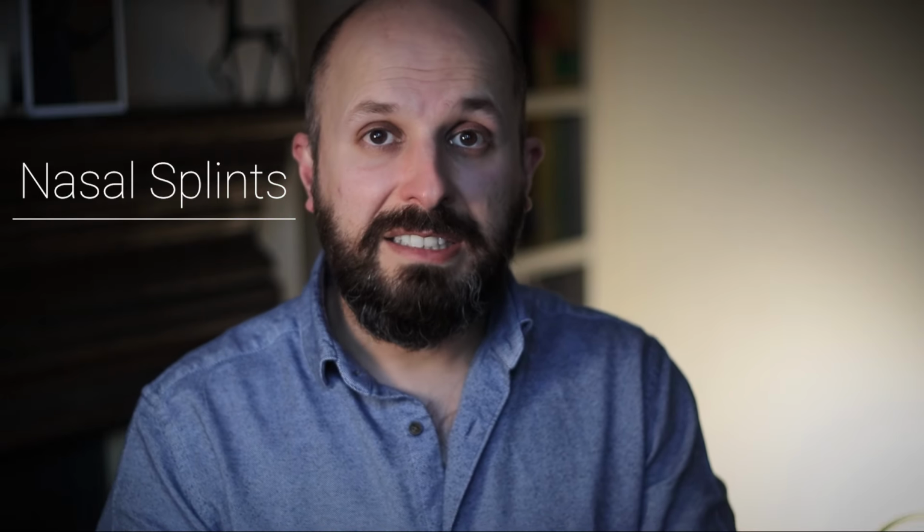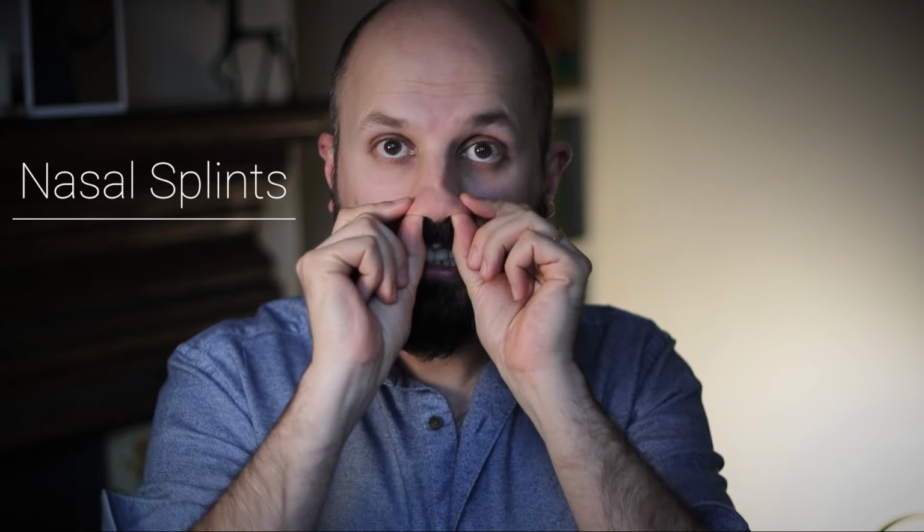Now there is a different type of nasal dilator, also known as a nasal splint. Instead of pushing something up your nose, it sits outside and opens up this way. Let me show you. I think everyone pretty much uses Breathe Right. It opens up the nose, and I think a lot of sportsmen, footballers tend to use it as well.